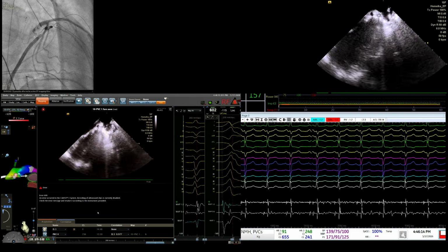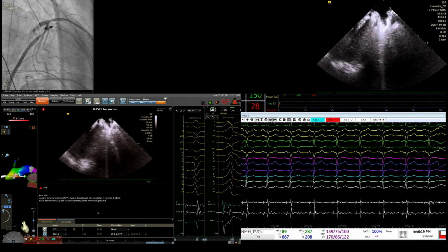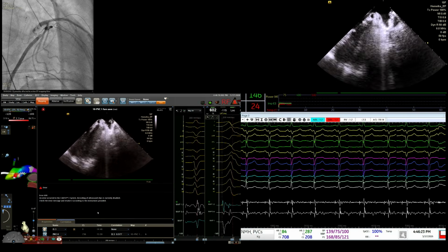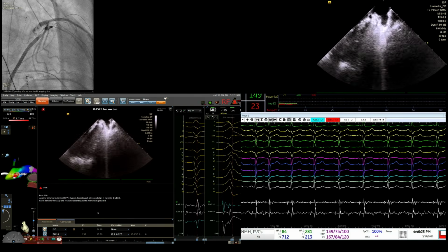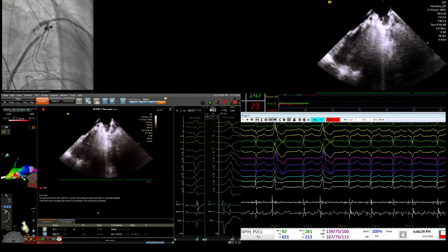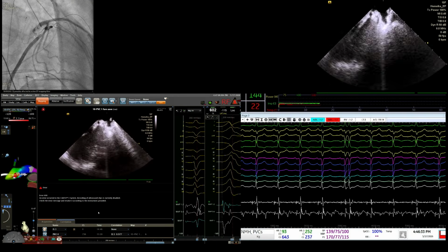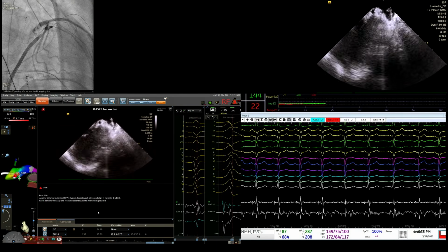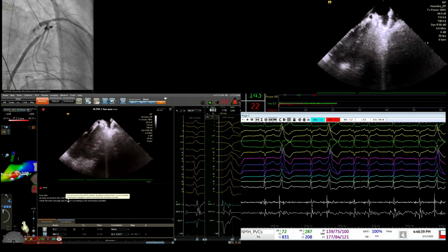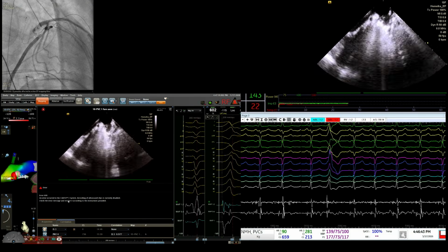I'm gonna do one a little forward because that was the other location, and we're still safe with the artery. Maybe the cooling effect is like that. You guys can see on eyes. You can see the white dot of the catheter on the vein. You see it, right? So here is the other one, the narrow one. We're gonna go forward a little bit. That's the other one. This is the one that is a little bit backwards, so we'll come backwards a little bit.